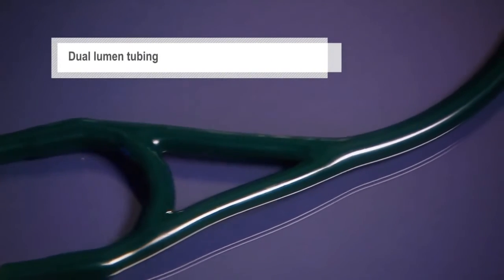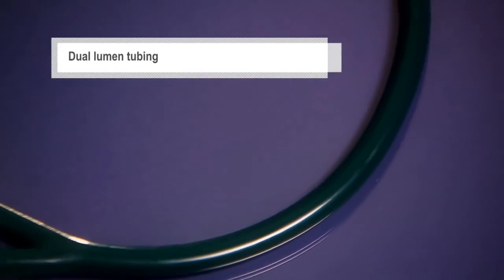The dual lumen tubing is actually two tubes in one, designed to eliminate rubbing noises.